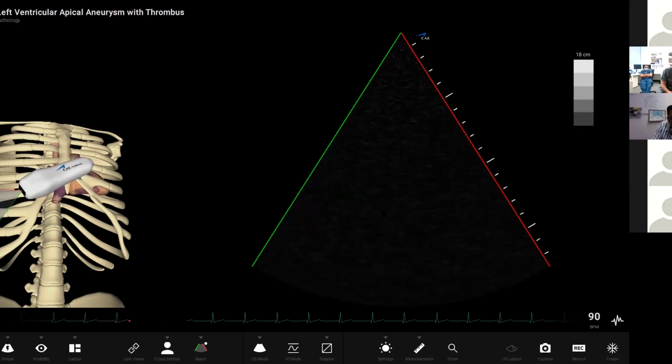If you're going off-piste, use that color Doppler and all available angles. For example, in the apical 4-chamber view, you tilt up to your 5-chamber, looking for aortic stenosis. You can also do that in your 3-chamber. You can also sometimes get views from that right parasternal edge, things like that.